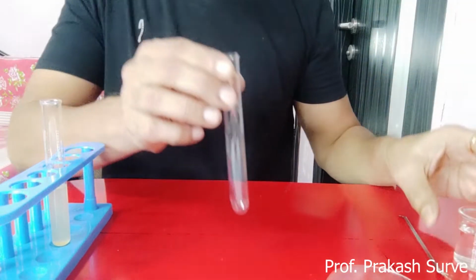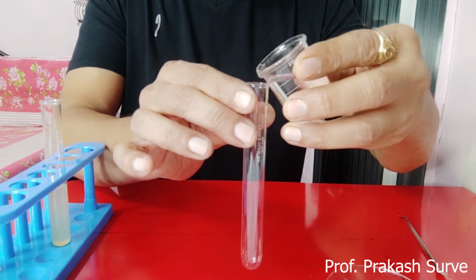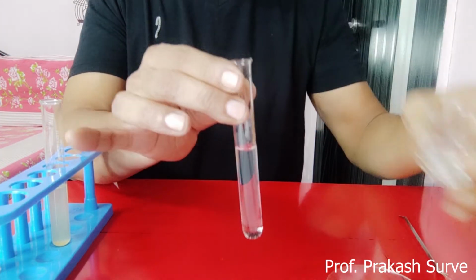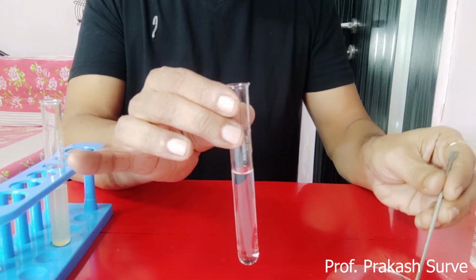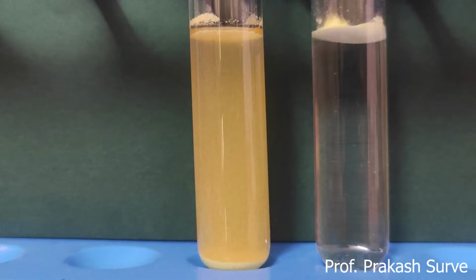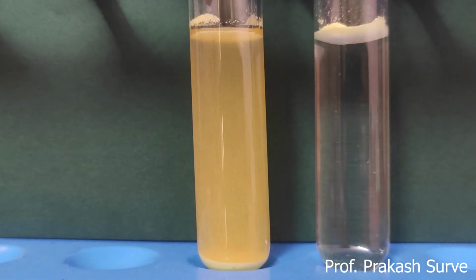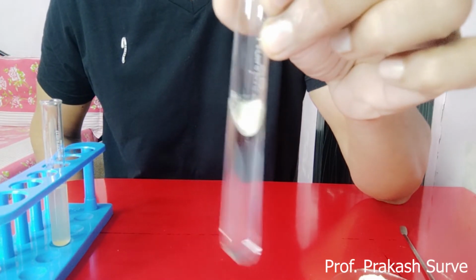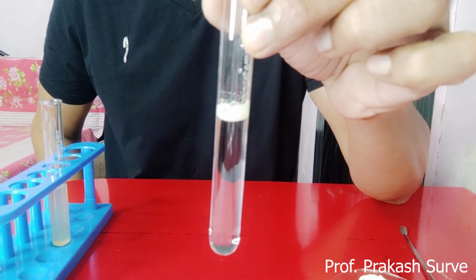In the second test tube, I'll take the plain water. Half a test tube, the same way. I'll sprinkle the sulfur powder on this, the same quantity of sulfur powder. So what I find here is that nothing is going down, no particles. Even after shaking, it is not going down.